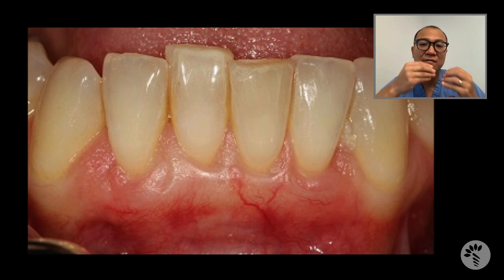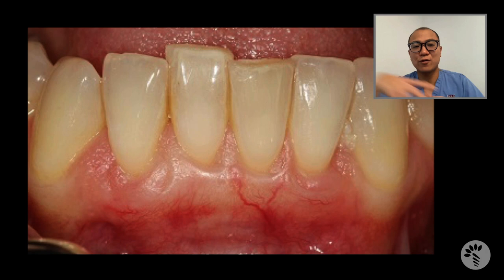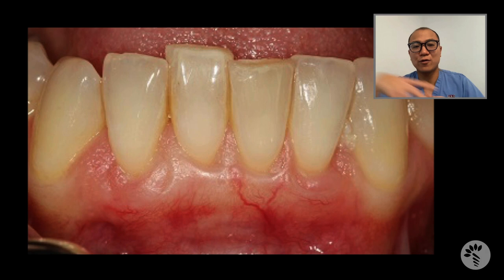You can clearly see that I totally converted the phenotype of the patient from a thin biotype to a thick biotype. Second, look at the significant gain in keratinized tissue. Third, I did not alter the vestibular depth — she still has a normal vestibule. And fourth, gingival recession has significantly reduced.